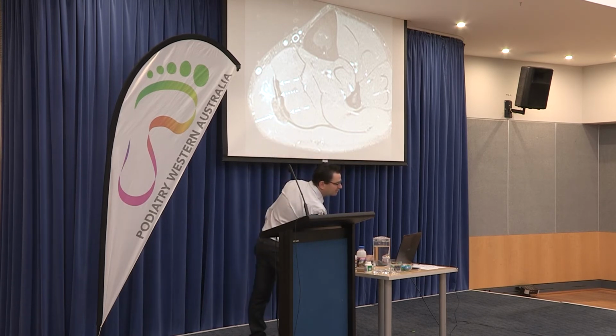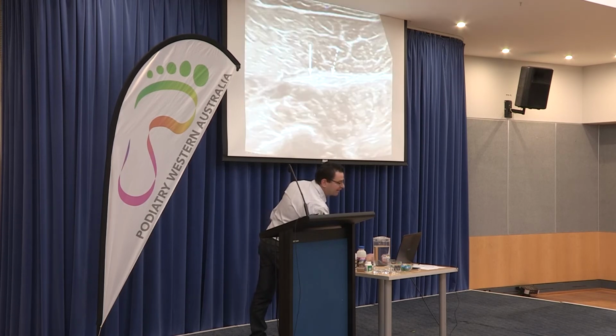So this is scarring of that medial aponeurosis, and on ultrasound it just looks like a big, thick, echogenic fat thing, whereas normally it doesn't look like that. That's the superficial fascia. That's what it normally looks like when we see it. You shouldn't see this big echogenic thing like that.